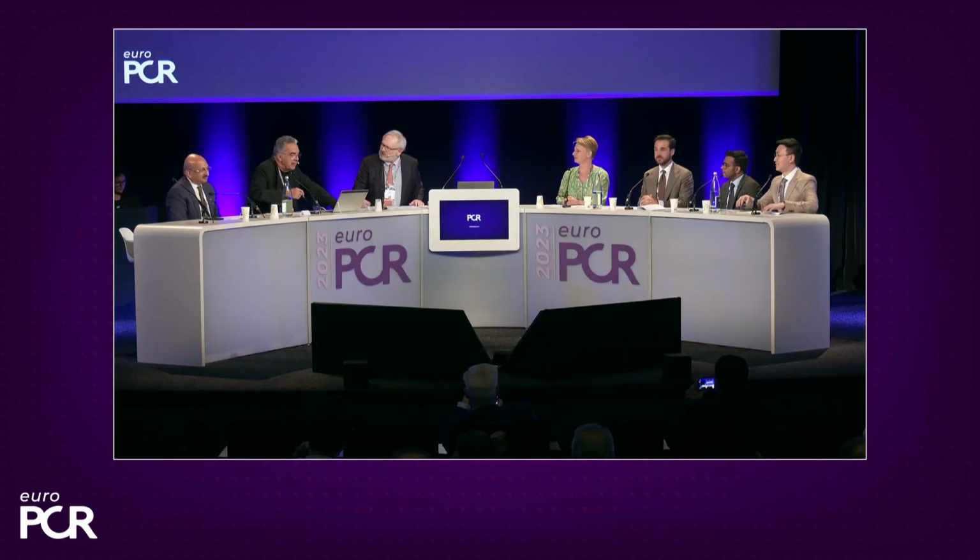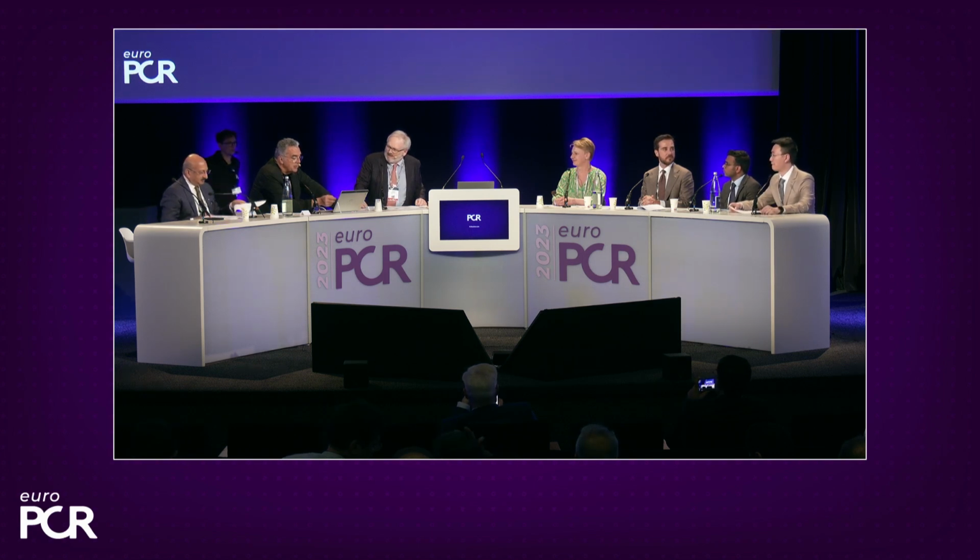Jean, I think you have questions. So we are going to leave the script a little bit and make some improvisation. There are 2 questions. One is concerning the Medina classification by angiography or by imaging. Any difference? Same? Who wants to respond to that? Why not John? Short response.